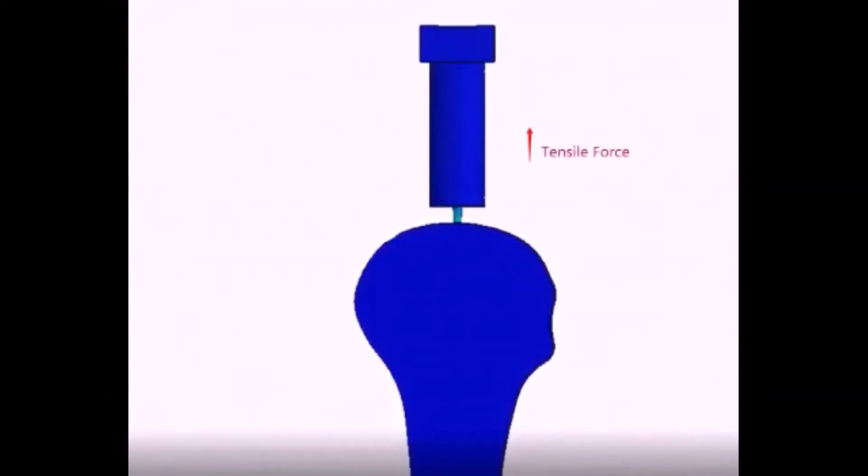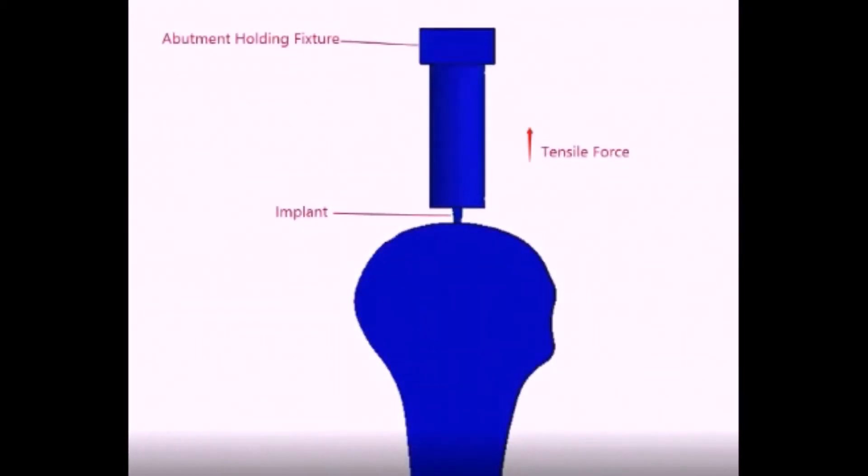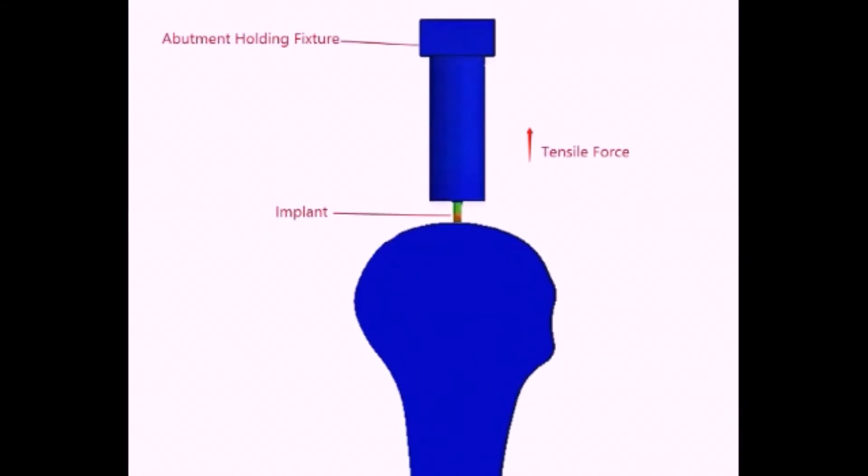Placement of the implant in the bone model follows the drilling protocol. After the implant threads are engaged in the bone model, the bone model is fixed at the bottom pneumatic grip of the machine. The abutment is fixed into the abutment holding fixture, and the abutment fixture is fixed at the top pneumatic grip of the machine.